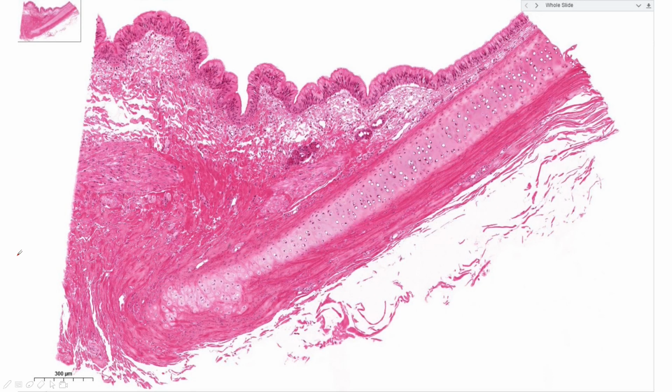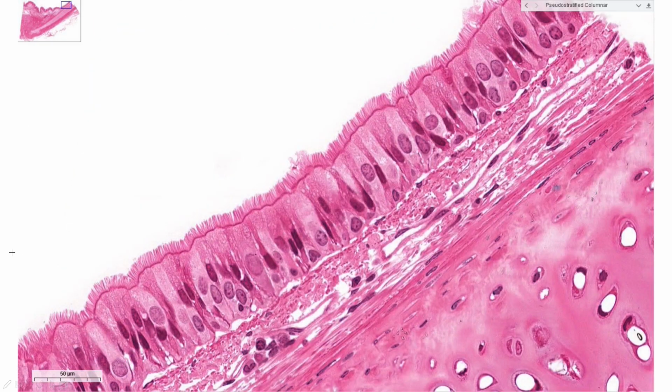The luminal surface of the trachea is lined with a pseudostratified columnar epithelium. The luminal surface is located up here. The trachea has many other types of tissues as well, including cartilage, located here. We will learn about that later. For now, we are sticking with the surface layer of cells. In this view, we can see the surface of the cells with cilia.